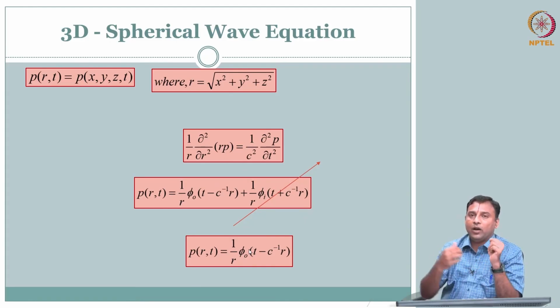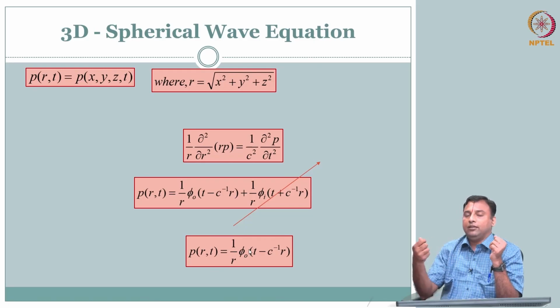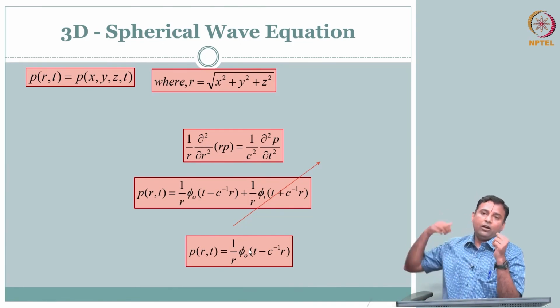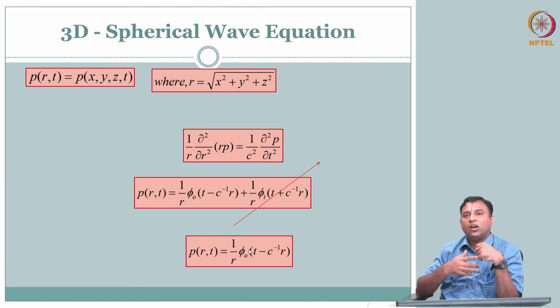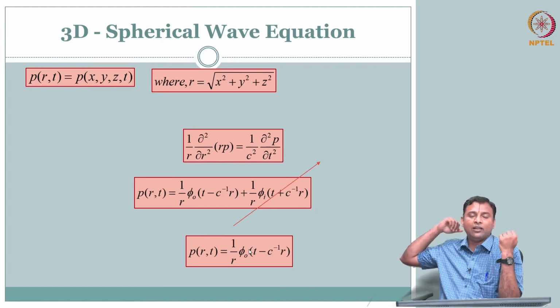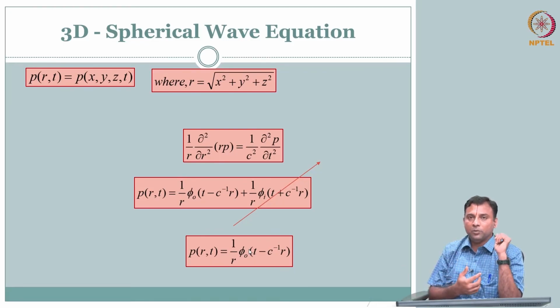That is the key. So, I want to send the wave into the body and the wave has to interact with the body, and I have to capture the waves that are coming out of the body after the interaction, one way or back, right? We had the through transmission or on the same side, right? That subtle difference we will make. So, first you have a wave, and we are able to describe the wave. Now, this wave has to interact with the tissue, which will be our next focus of attention. And then we will talk about the configurations, whether you want to send the wave from one direction and detect it on the other side, or you want to send in one direction and receive it in the same direction. All those nuances we will talk about. Okay.